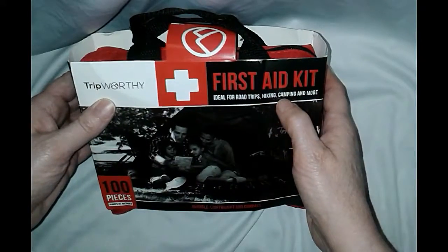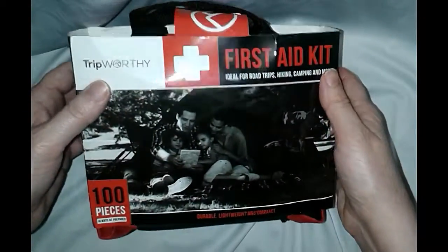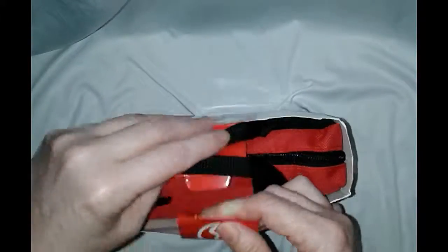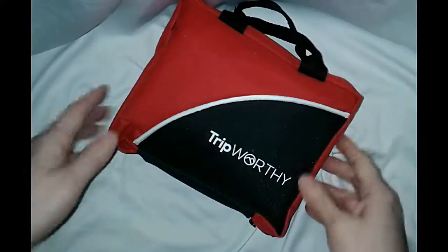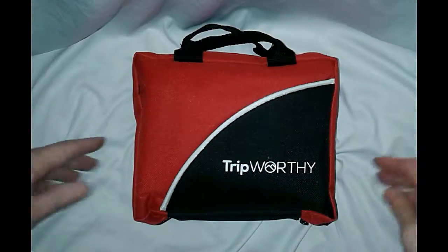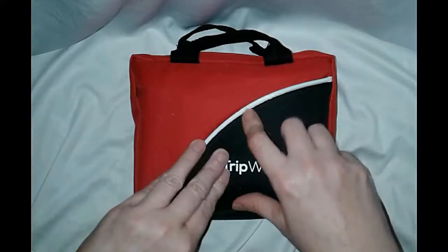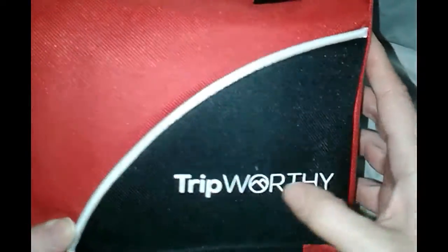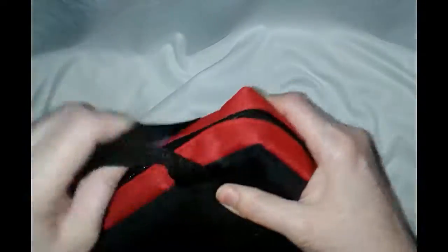It says it's ideal for road trips, hiking, camping, and more. It's nicely put together — the size of my hand. It's real nice vinyl with nice stitching, the brand name is stamped on, and it's real nice nylon.